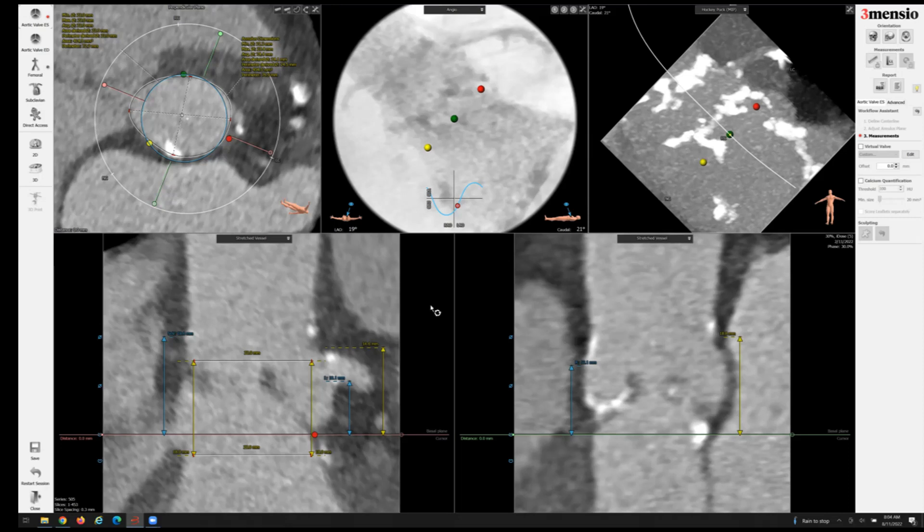I've already completed the workup that I've previously shown in a different video. On the bottom left panel, I've drawn out a few structures. You can see the left main here — the height is around 10.1 millimeters. The left sinus height is around 16.6 millimeters. And on this view facing the left main, there is a very tall left coronary cusp.